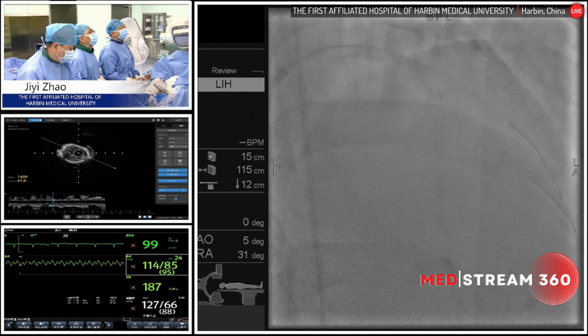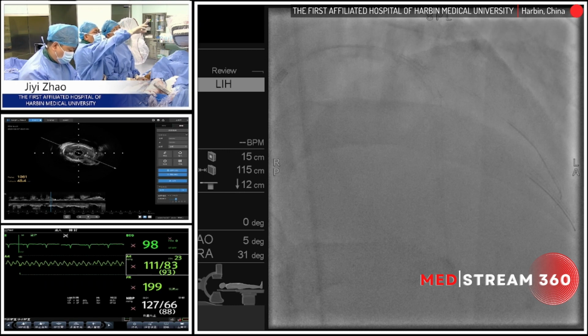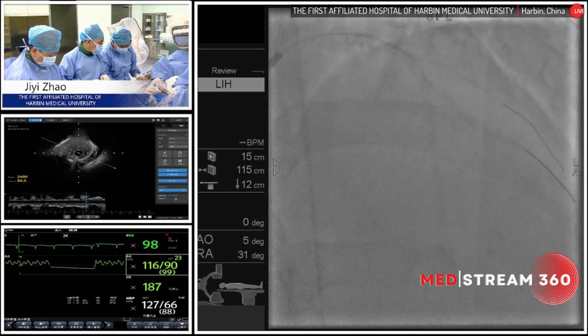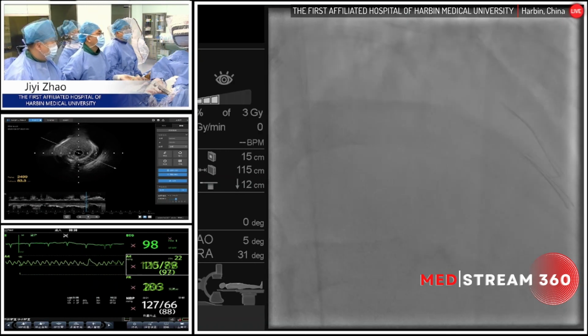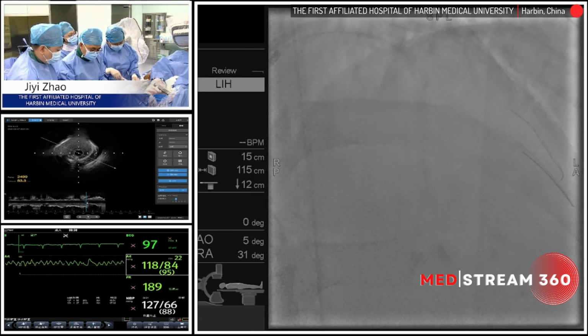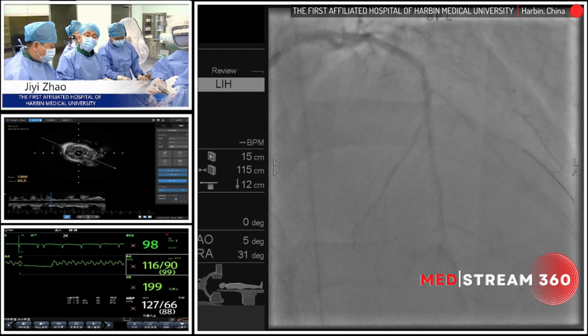However, we notice that the plaque burden of this patient is so severe, and there are also some well-controlled superficial calcification cracks. So my suggestion is that maybe we use a cutting balloon or something to make further plaque modification before the stent implantation, maybe a 2.75 cutting balloon.